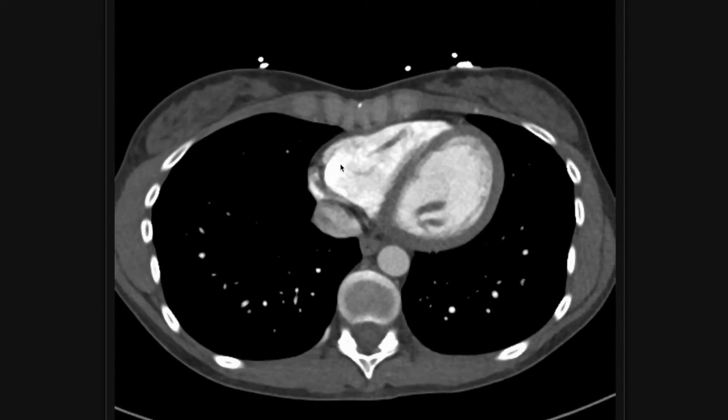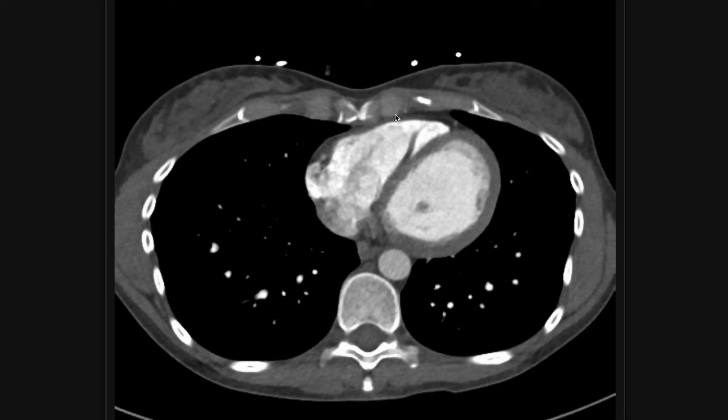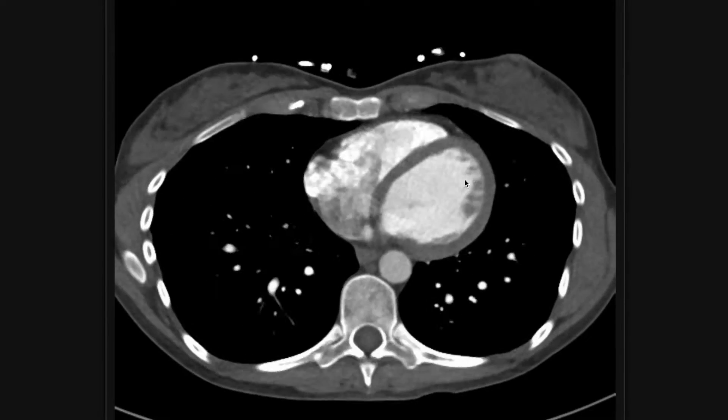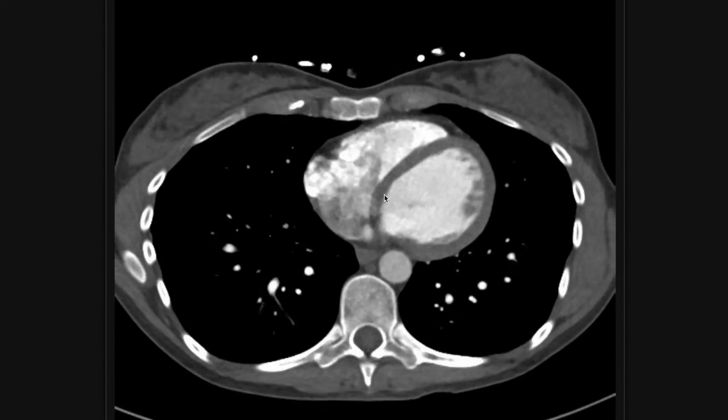Look at all your cardiac chambers — you've got your right atrium, right ventricle, left ventricle, and left atrium.